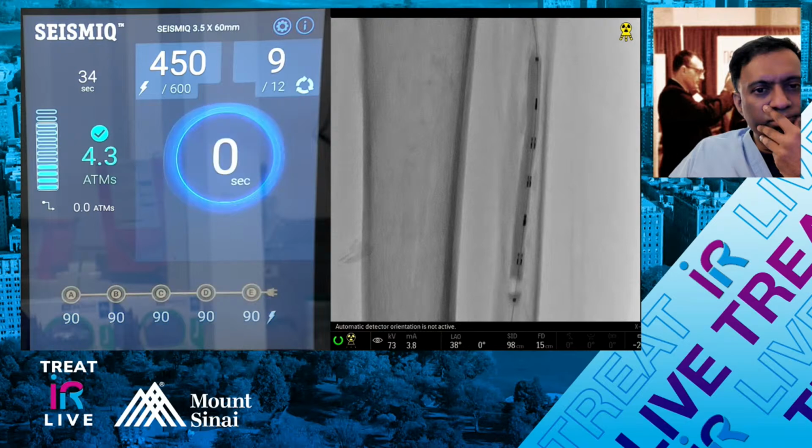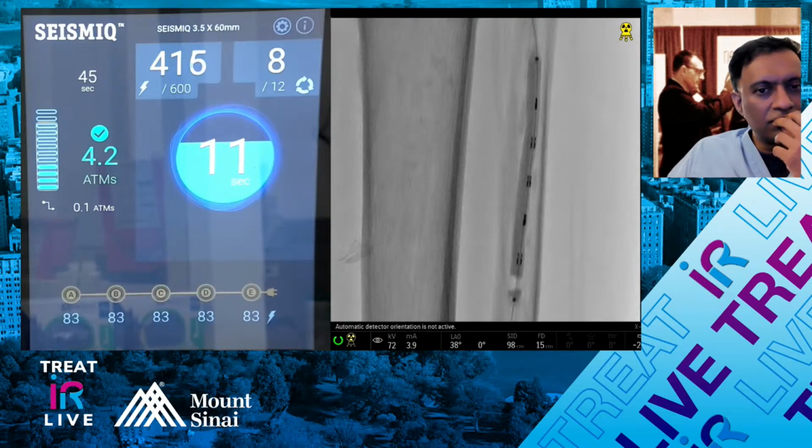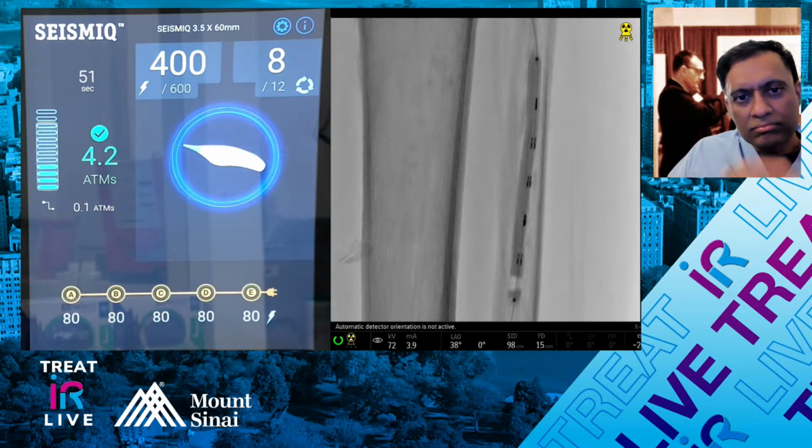You can see that this catheter has 600 charges built into it. Right. You could also think of it as 120 charges in each of the emitters. And again, the pressure is still dropping. Raj isn't touching this at all. So we're literally in real time changing the compliance of the vessel to be able to reflect the therapy of the IVL. Let's deflate this now and take this out.